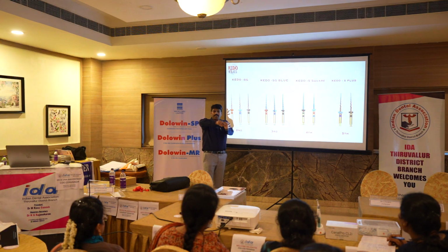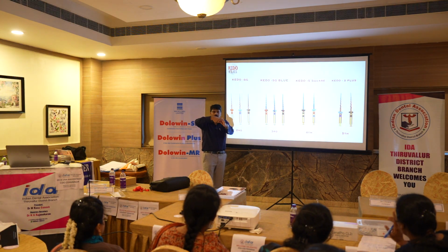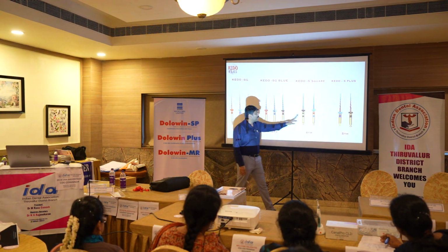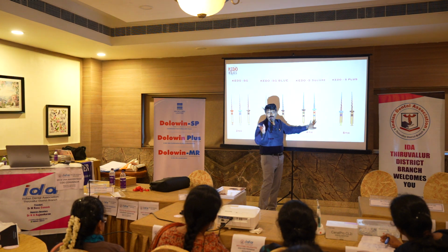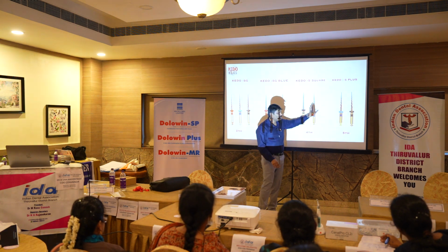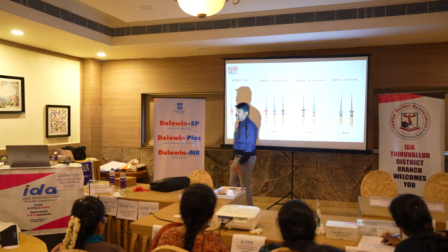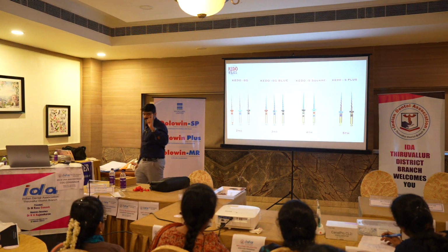Whenever you put it inside the canal, you have to swipe 1, 2, 3, 4, four to five times maximum, until the working length. End of the story. Same here, no problem, no changing the file. Do access opening, 15 size K file, molar, swipe it 5 times, finish. Swipe the anterior 5 times, finish. Understood? There is one file which will never break in primary.